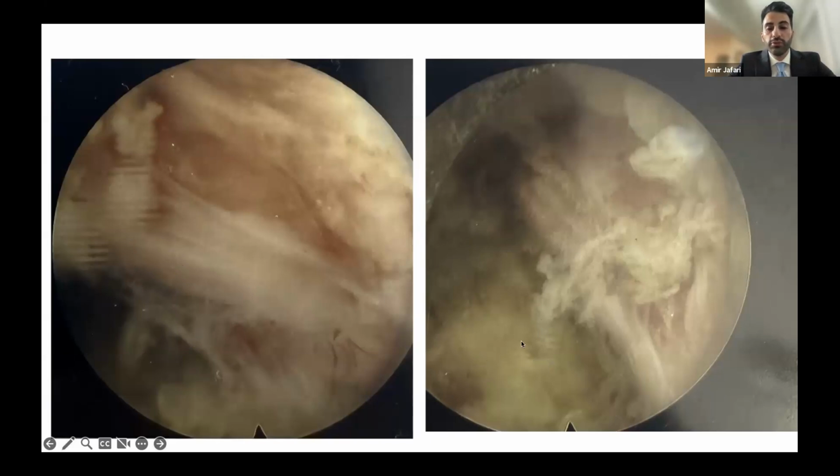We have shrunken it. We have used the Trigger-Flex device, which is a bipolar cautery device. We've shrunken the disc; it uses heat and electricity to shrink it. And this exiting nerve, this is the medial portion of it, and this is the lateral portion of it. If you use the scope and look laterally, I did that. We decompressed underneath it and continued.